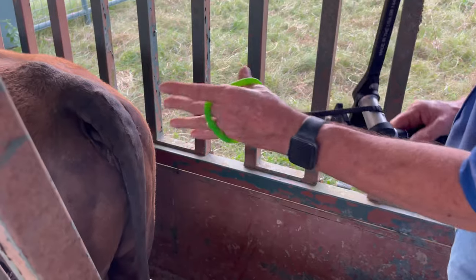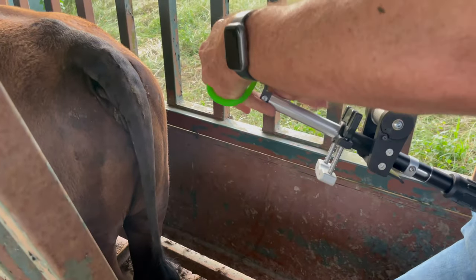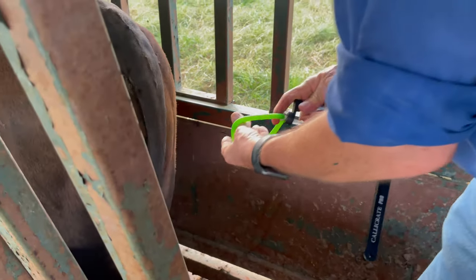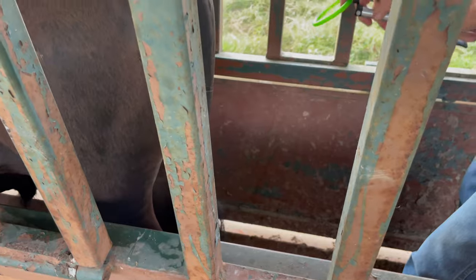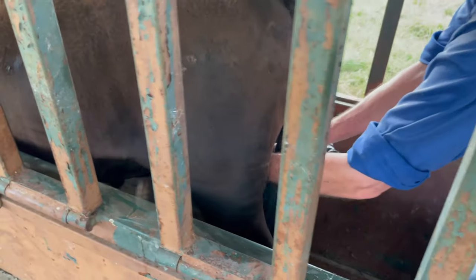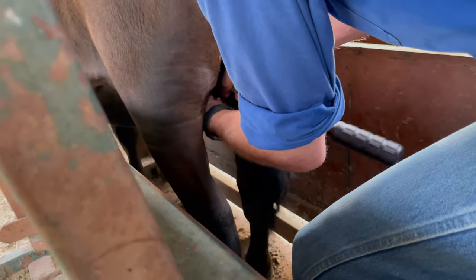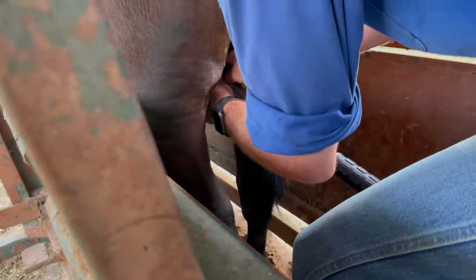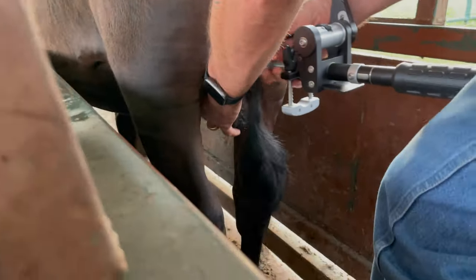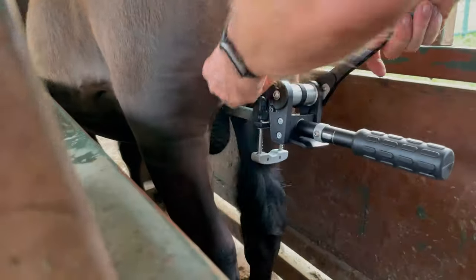I like to put my three fingers and thumb through the band, and you want to hold on to this right here so it doesn't get away from you. I'm going to get up in here — and you think to yourself, well, how does he keep from getting kicked? The answer is, sometimes you don't. So I got it positioned above the testicles and I'm going to start the ratchet going.